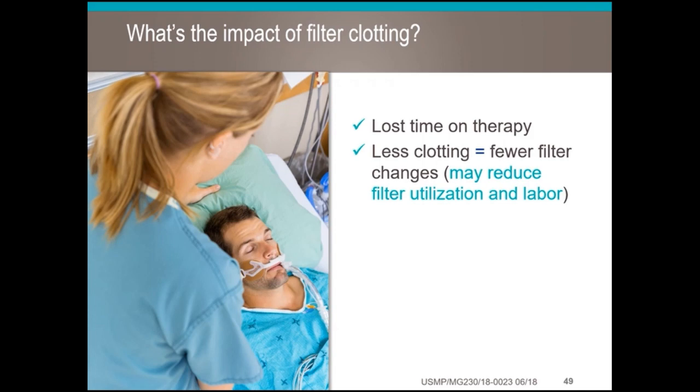Also, with clotting, if you're not always able to get the blood returned to the patient before the clotting alarm occurs, there could also be the potential for blood loss for your patient as well. So there are some negative consequences to your filter clotting.